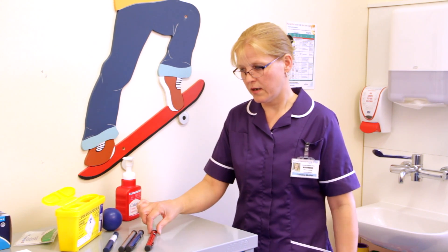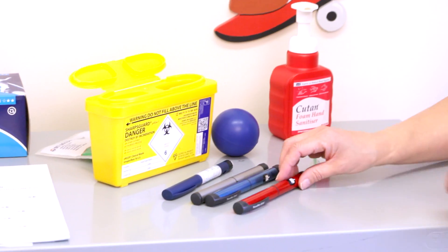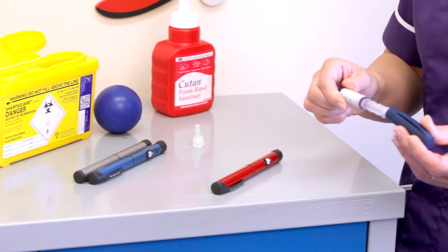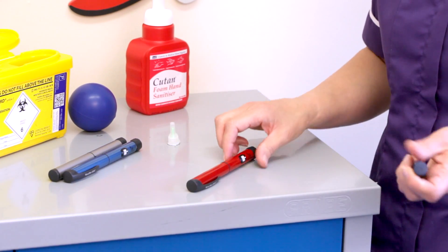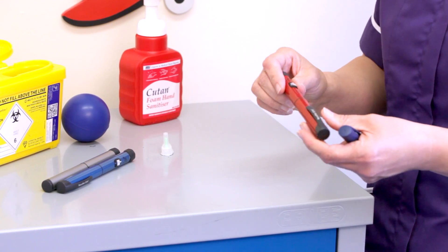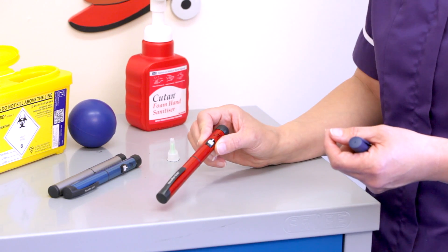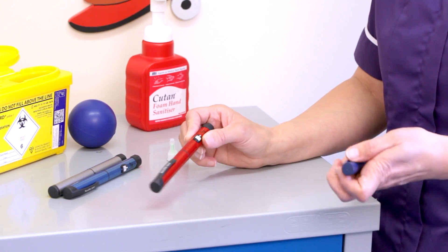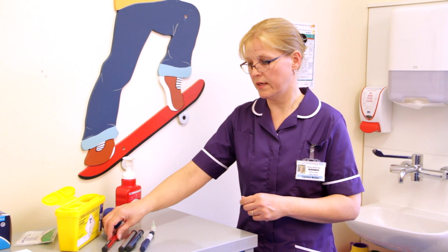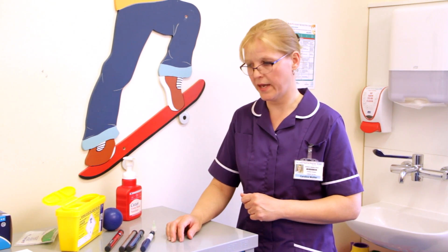There are several different types of pen devices. The main differences are that there are disposable pens which get thrown away once they've been finished, and there are pens that have cartridges in. Some pens dial up in half units and some pens dial up in full units. Depending on what pen you use, your individual diabetes nurse will run through how your pen works.